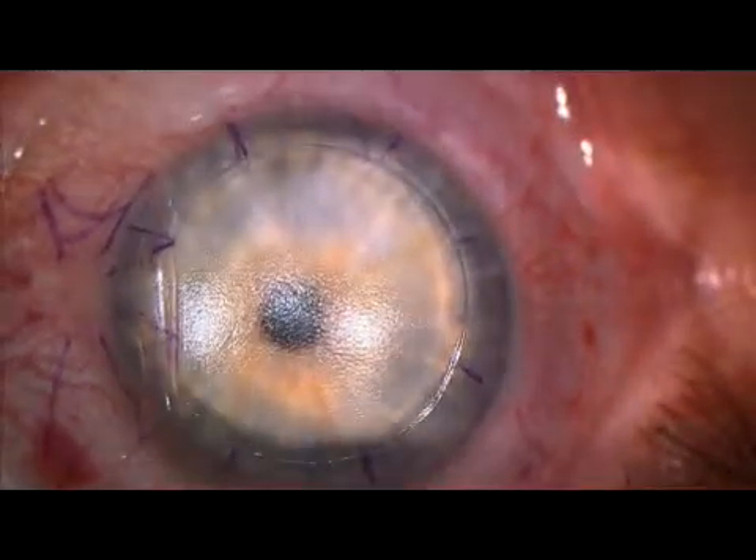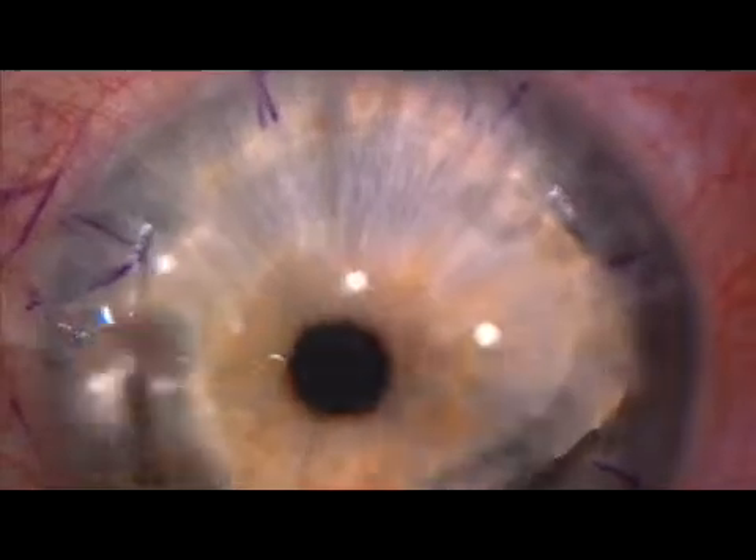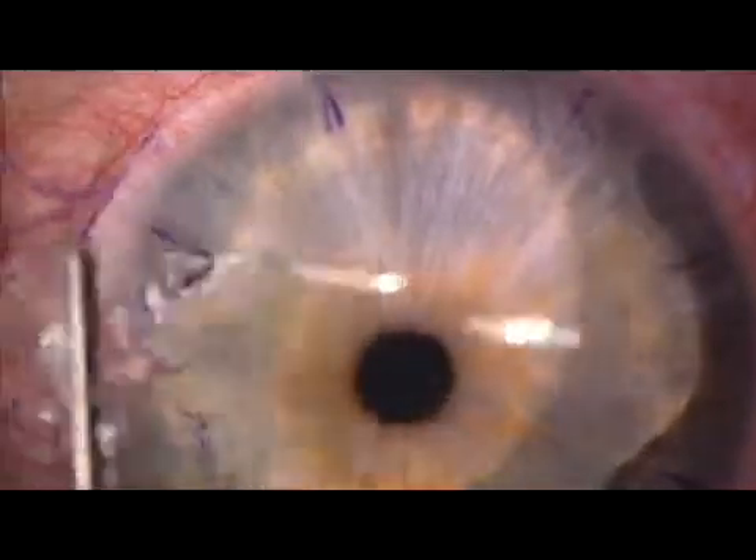The bed is always dry, and thus this drying step was not necessary. Higher magnification shows the even texture of the exposed stromal bed. Laser is applied, and the flap is rehydrated and put back into position.